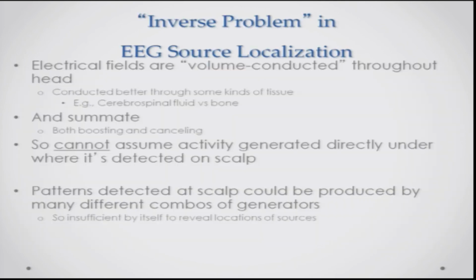So, as I said, with the inverse problem in EEG source localization, it is very difficult for us to tell from the recording where it is coming from, but EEG is very useful in catching rhythmic activity in the brain, like it appears in sleep or in epilepsy or in an abnormal encephalopathic state. So, EEG really tells you what is happening in the brain in the dynamic temporal process, whereas MRI tells you where it is happening. So, I guess this is a good introduction. We will keep talking about EEG as and when we come to it further. Thank you.